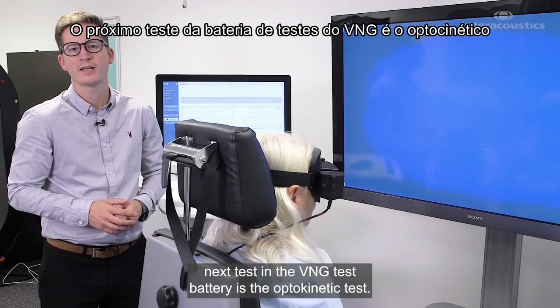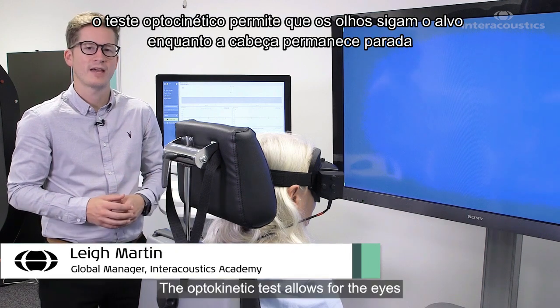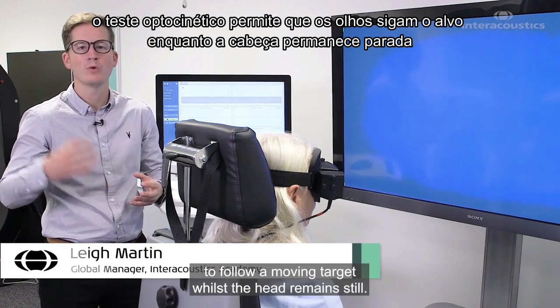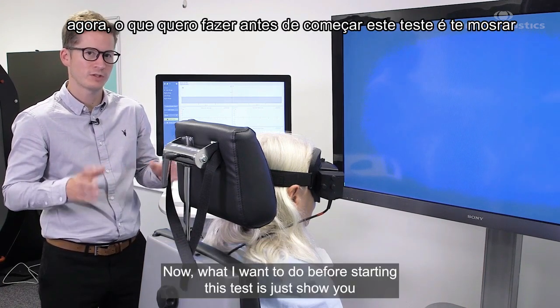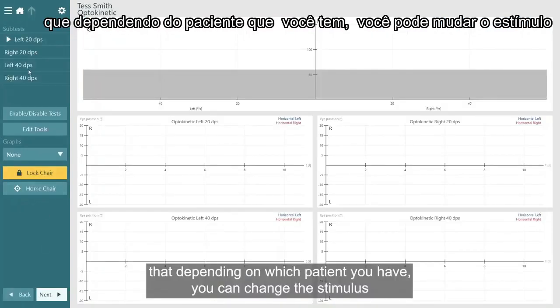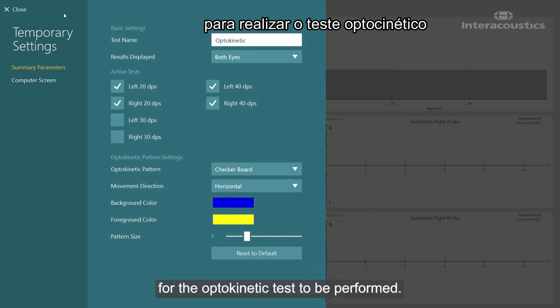The next test in the VNG test battery is the optokinetic test. The optokinetic test allows the eyes to follow a moving target whilst the head remains still. Before starting this test, I want to show you that depending on which patient you have, you can change the stimulus for the optokinetic test to be performed.